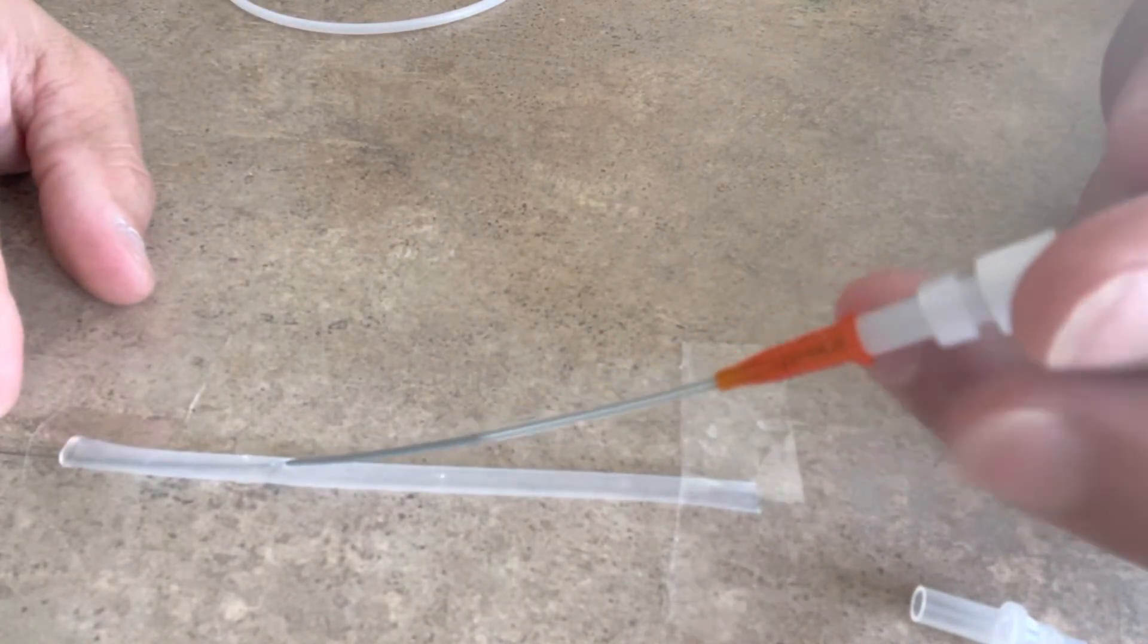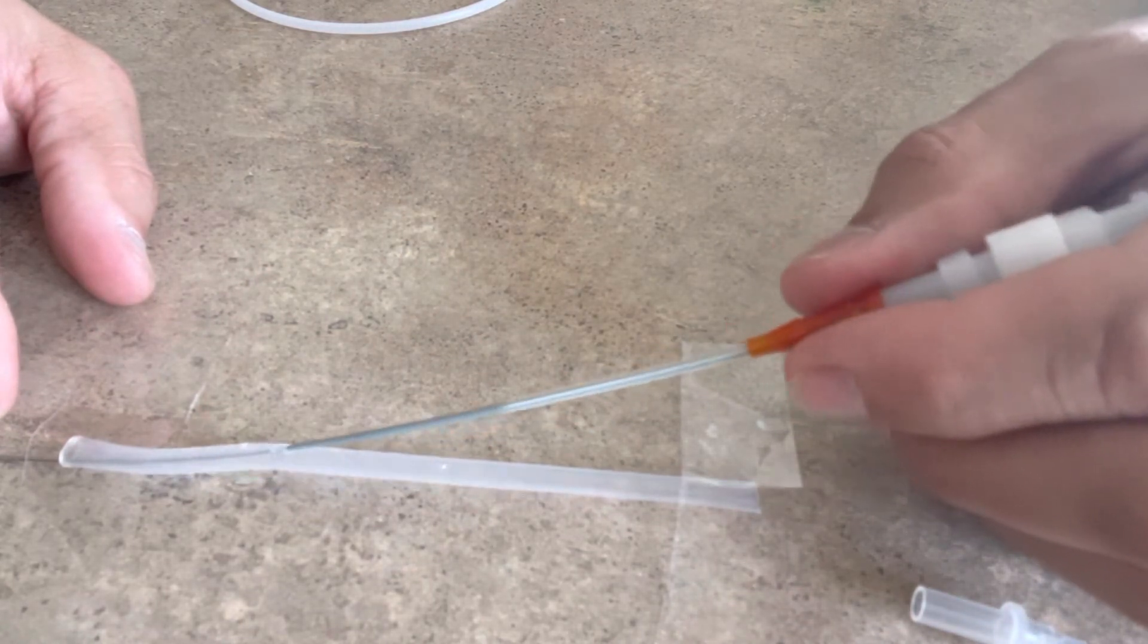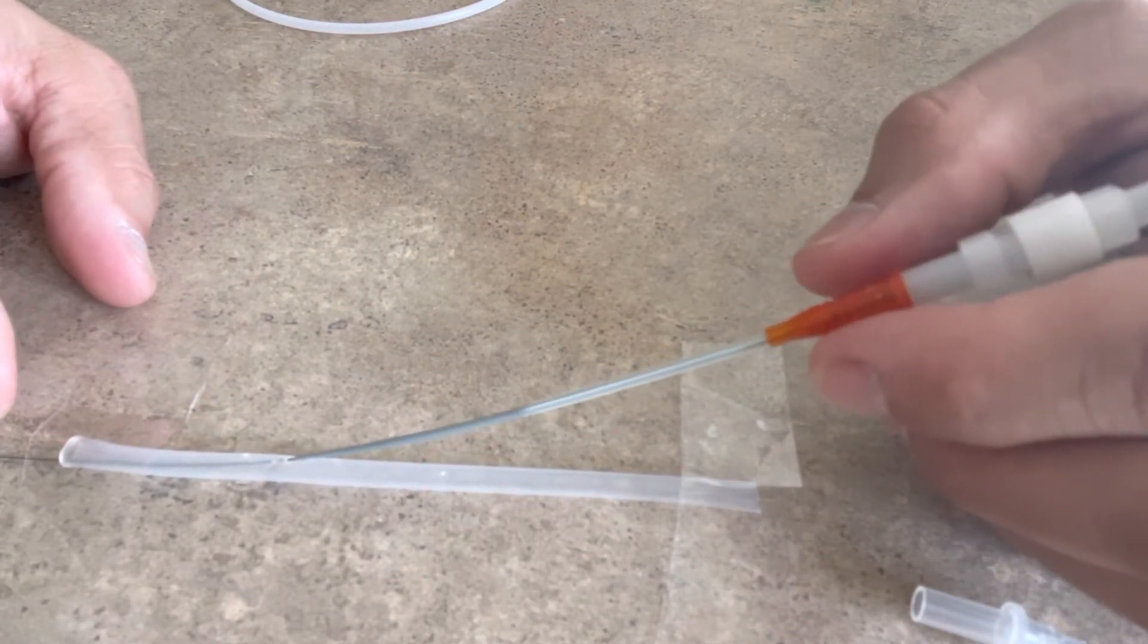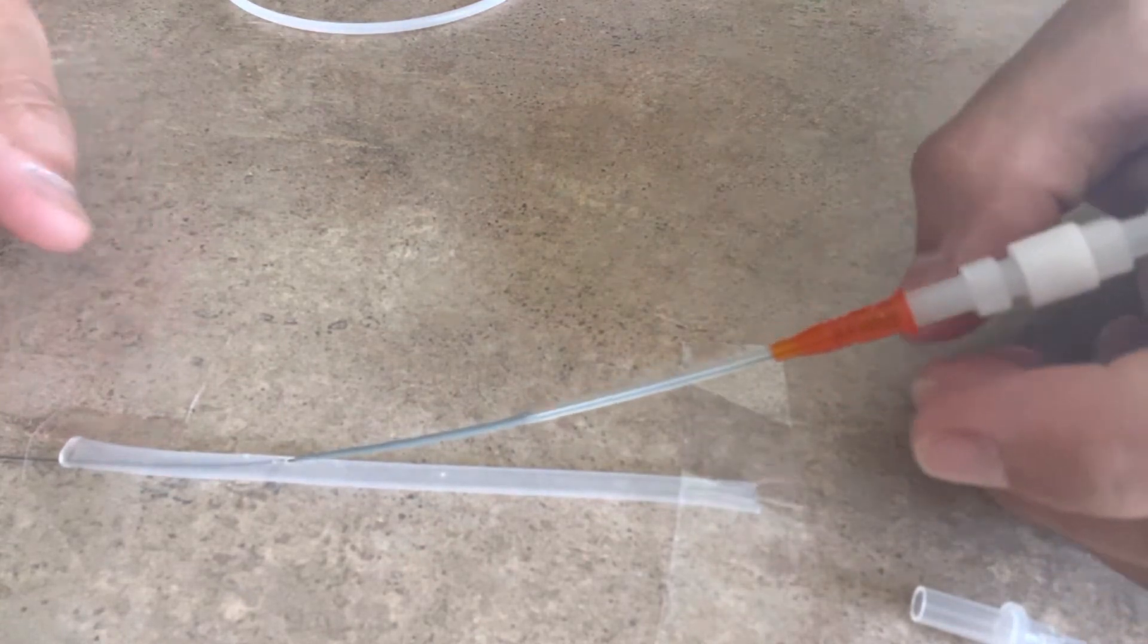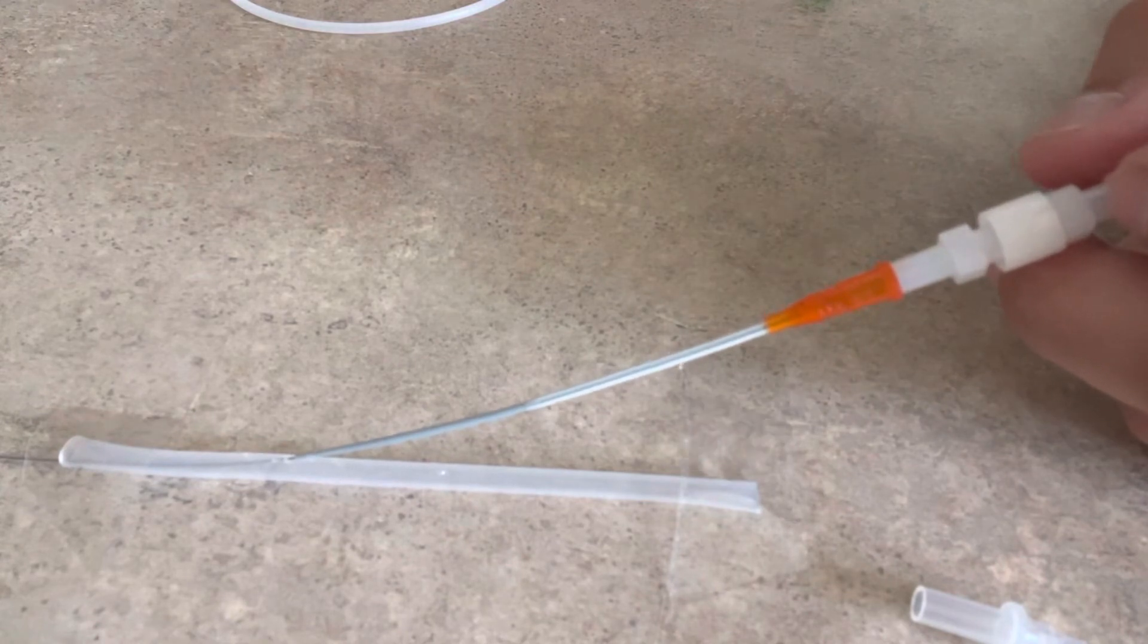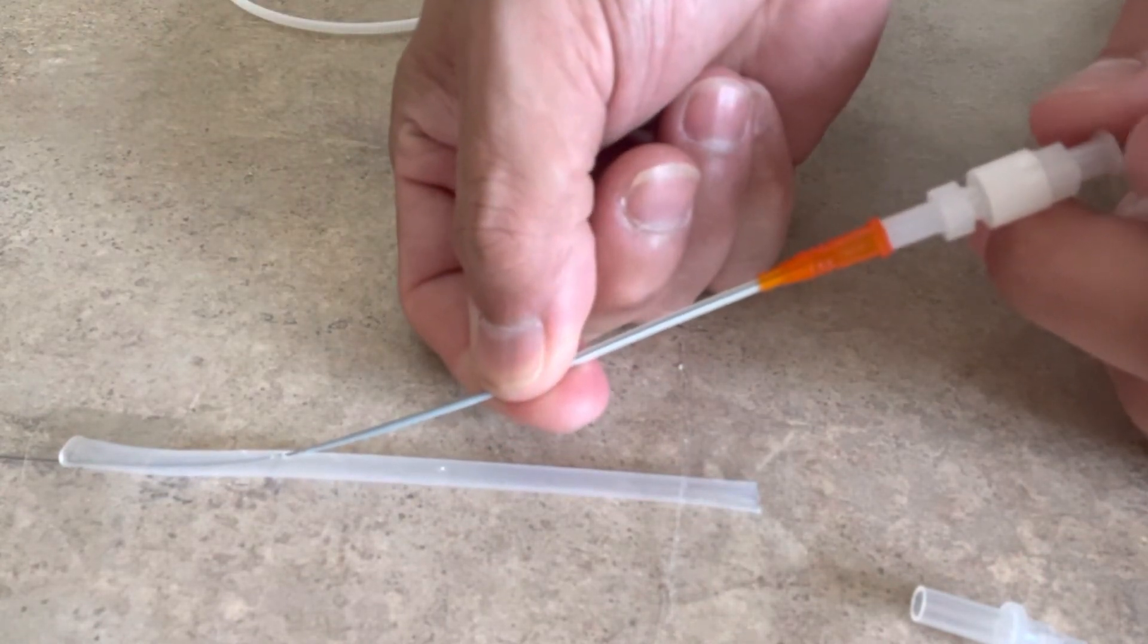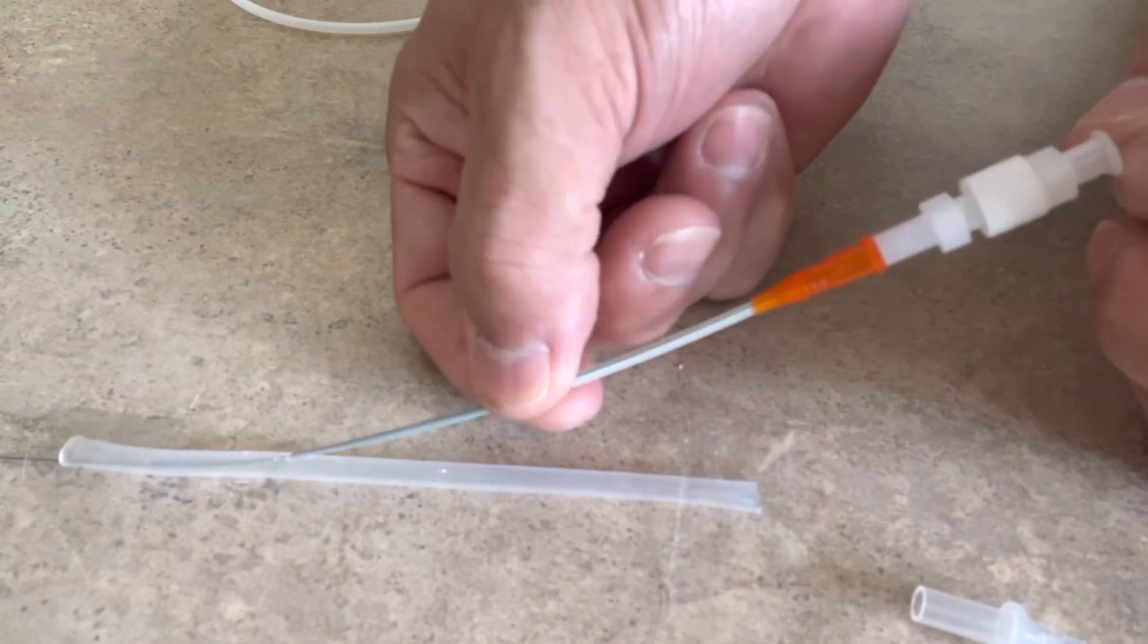So like any standard Seldinger technique, I'm going to hold my wire at the back end over here. But the key thing to this here is before you even get into the vessel, what you have to do is actually get through the skin. In order to facilitate getting through the skin, I'll take my finger and I'll pinch between the angiocatheter and the dilator and keep them together.